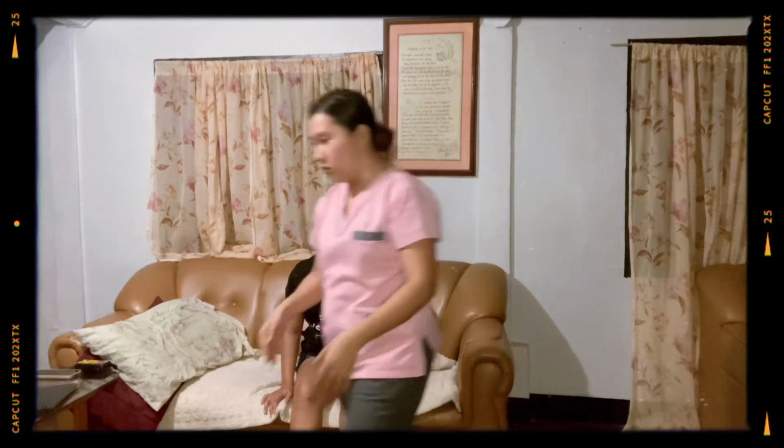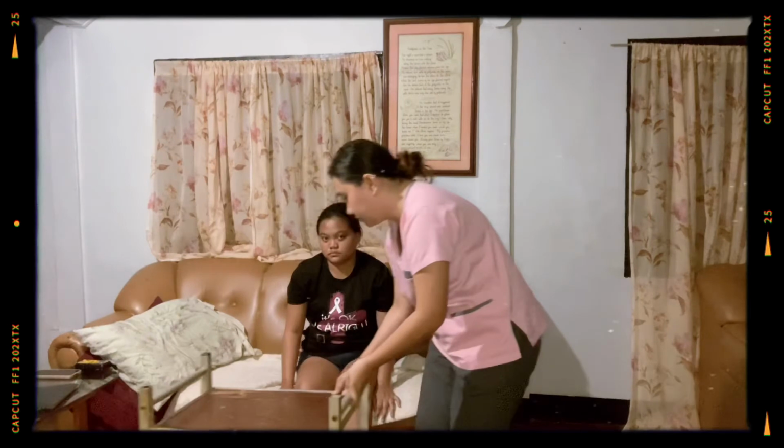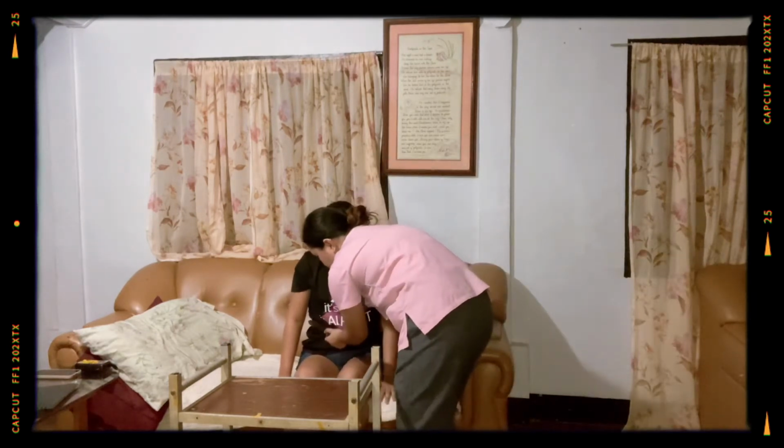So for procedure number 9, place the walker directly in front of the patient. So ask the patient to push him or herself off the bed or chair. So make use of the stand assist device or assist the patient to stand. So ma'am, we are going to stand now. 1, 2, 3. Yeah.